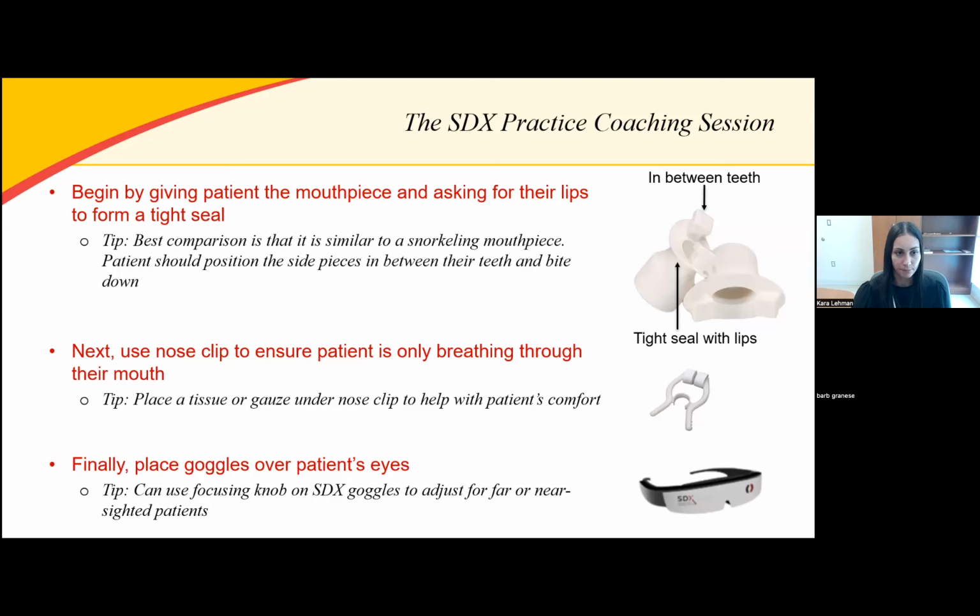But at this point during the coaching session, we actually just connect the mouthpiece and the nose clip, but we do not give the glasses to the patient yet, because we don't really need them to see the computer screen at this point.